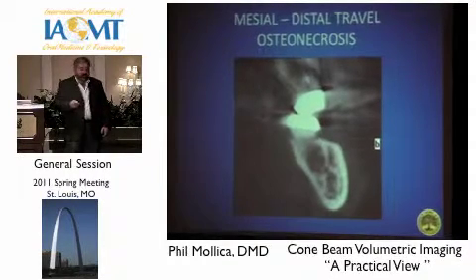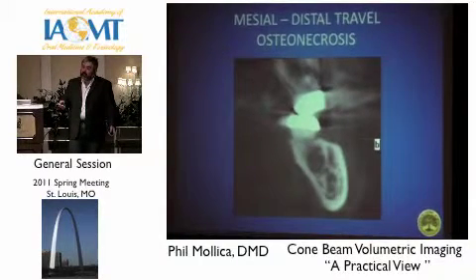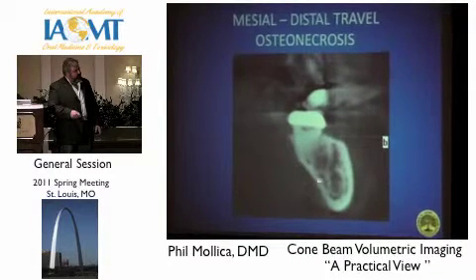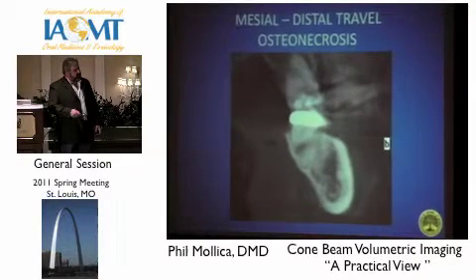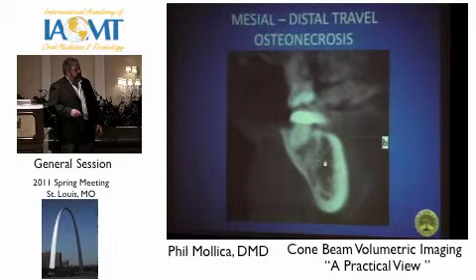Now the trick here is this. Well, okay, gee, is this thing just strictly located in the area that we obviously see? No, it continues on. We can follow this track right around that molar itself, right through. Gets a little bit bigger. It's all three-dimensional. Once again, here.